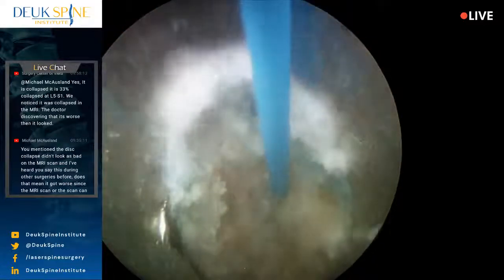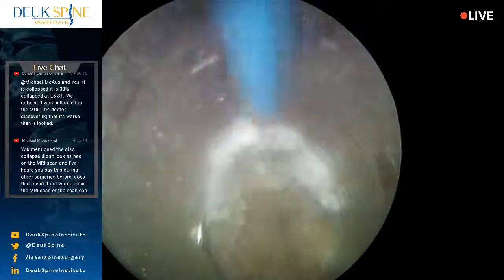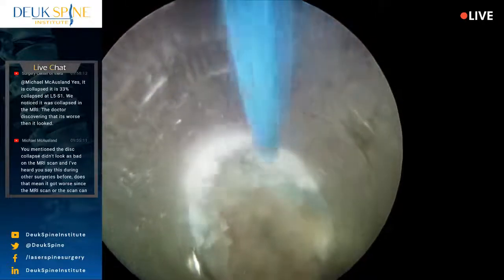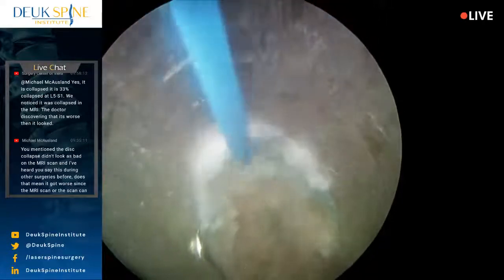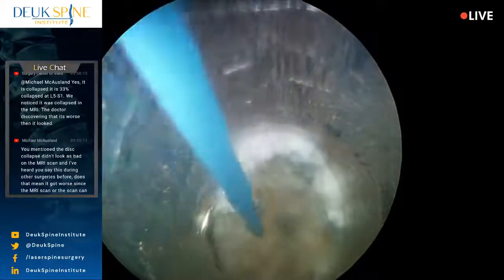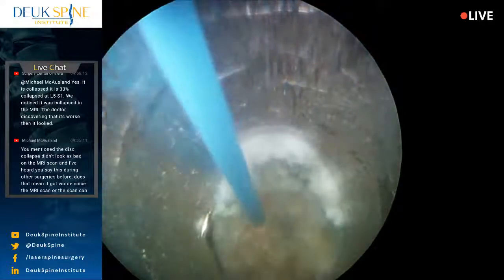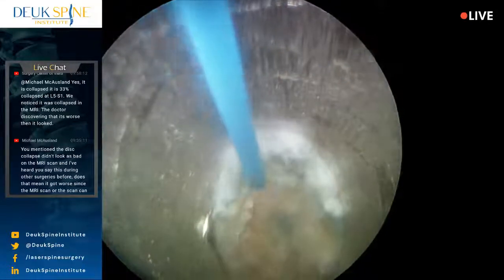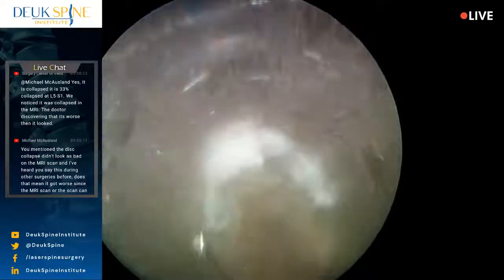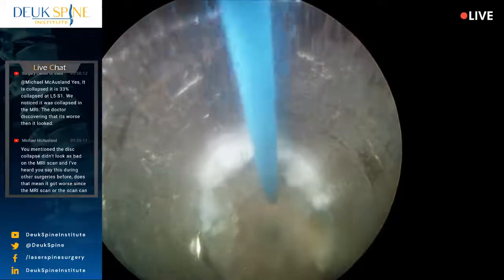It basically becomes a microdiscectomy because they're removing bone from the lamina, they're removing ligaments, and that is going to destabilize the spine. So I don't recommend the translaminar endoscopic approach to the L5-S1. I recommend the transforaminal, but there's not very many surgeons that are able to do it. Literally worldwide, there's probably just 5 at most in the world that can do transforaminal L5-S1. Like we're doing right now.